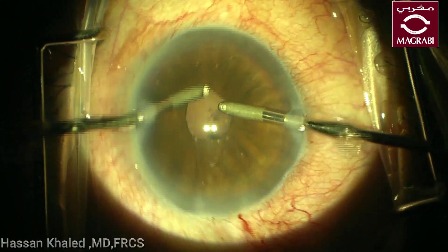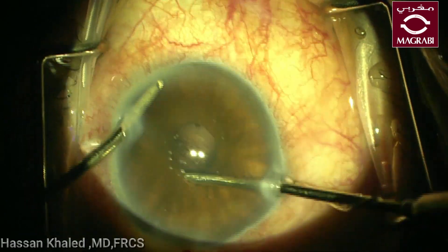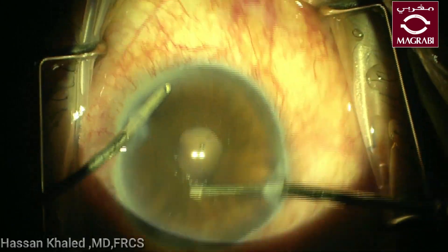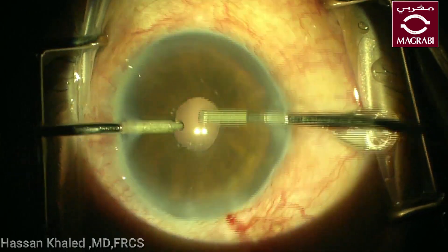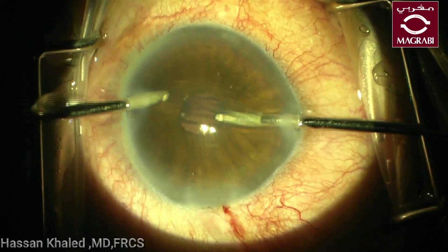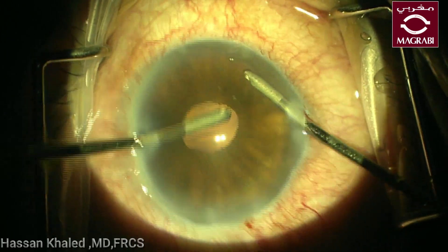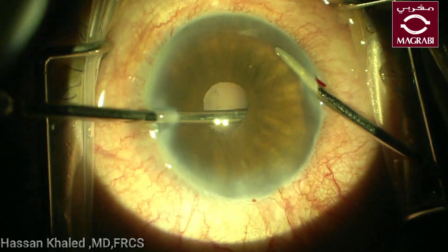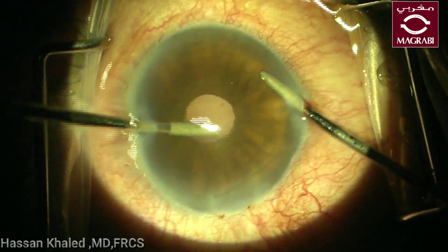You can see the emulsification of this cataract was done perfectly. You can see the pupil is very narrow while removing the cortex using the bimanual irrigation-aspiration — the pupil is about two or 2.5 millimeters in diameter. You can push the iris with the irrigation probe while removing the cortex with the aspiration probe. You can see the cortex has been washed perfectly.